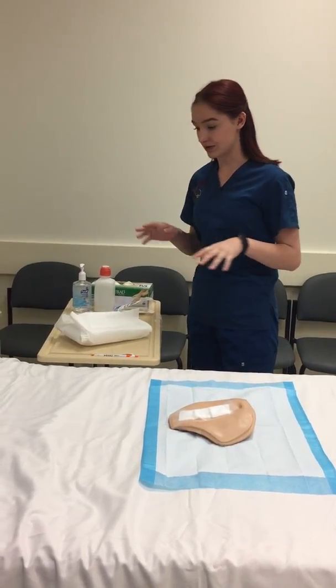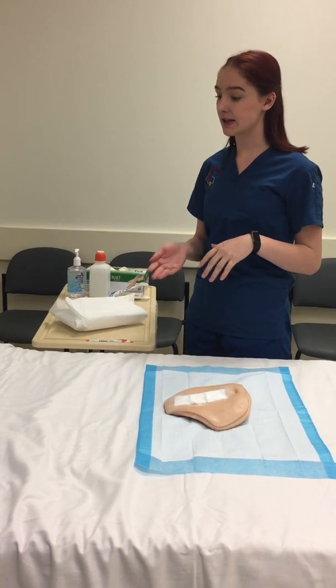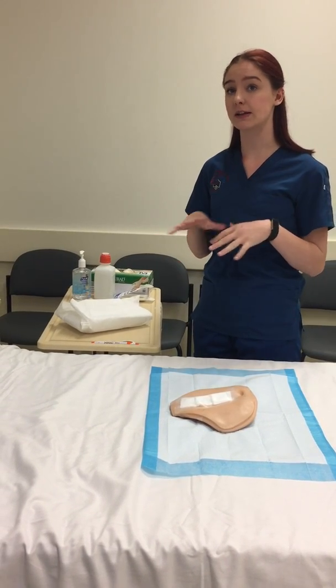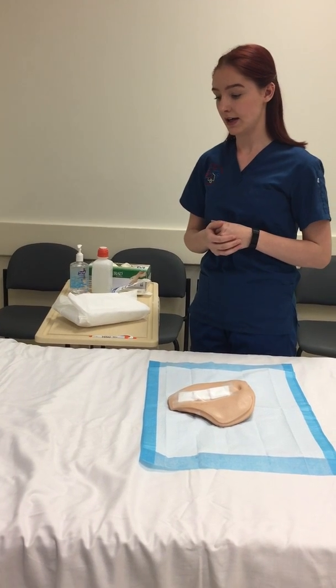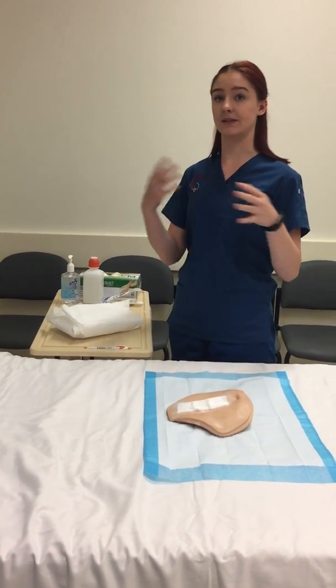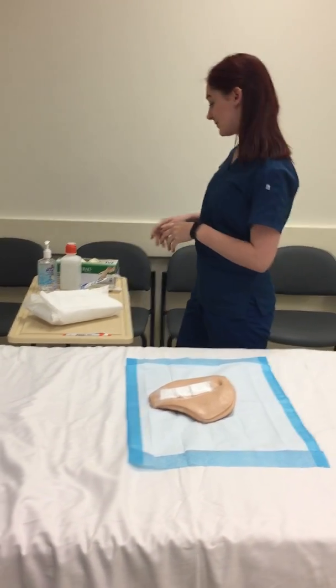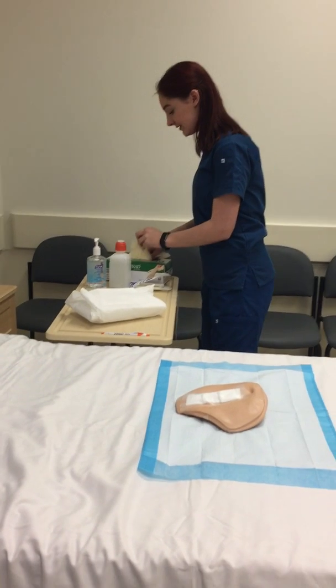And so I'm going to explain that I'm going to be taking off this dressing, cleaning it with normal saline. It should be pretty painless. Let me know if you're feeling any pain. And then I'll be applying a new dressing as the first round of dressing changes for the day. So I'm going to apply my gloves.